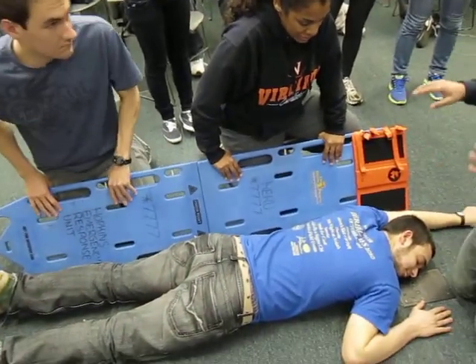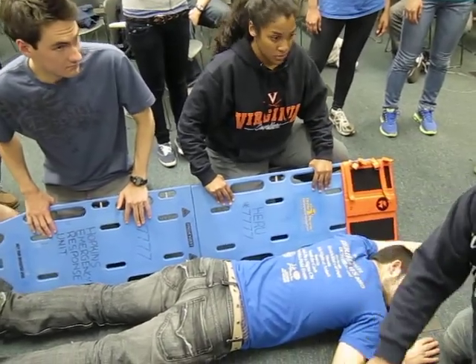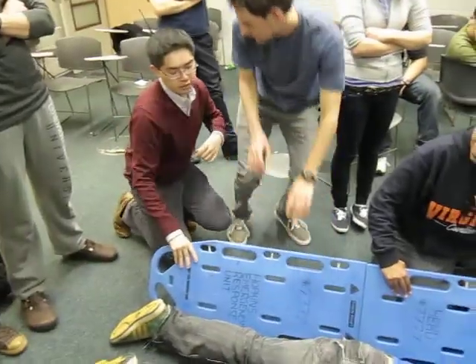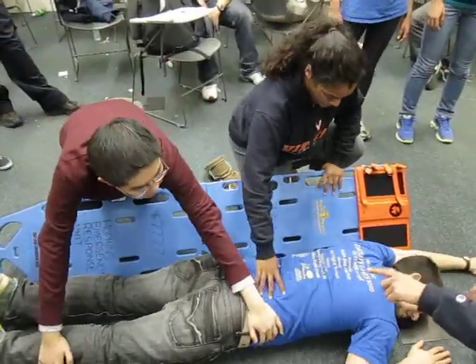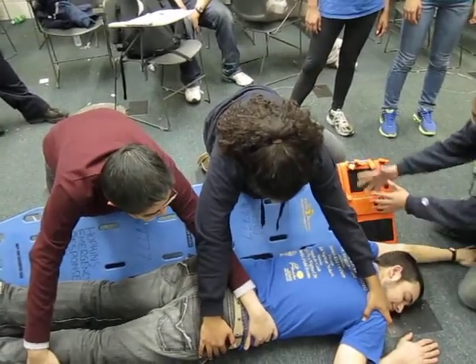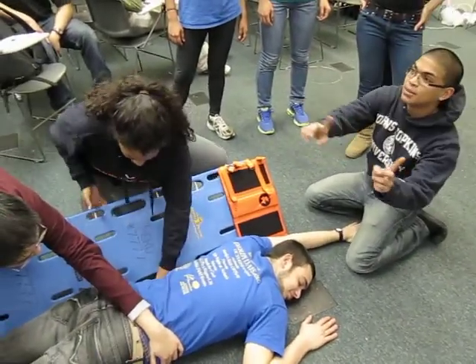The goal of this is to get them on the board but not have you stuck under the board. It's a very quick, fast movement. You're going to roll him on the board so that he's facing up — so that when he rolls, his head is going to be facing up.